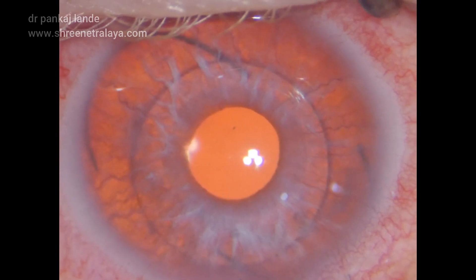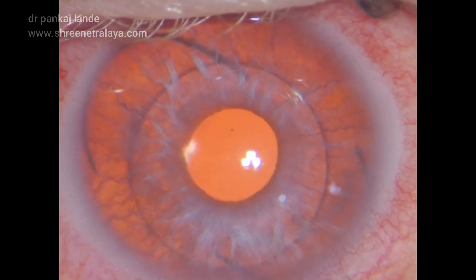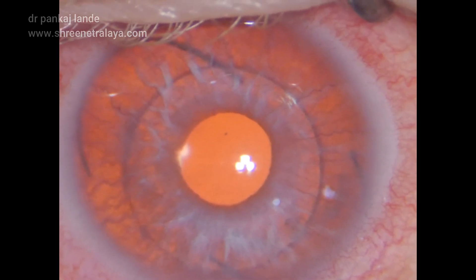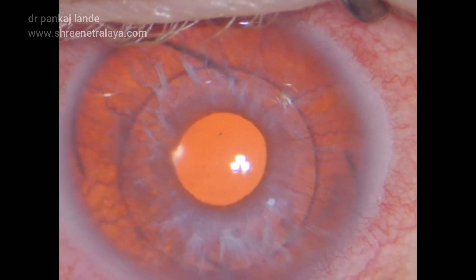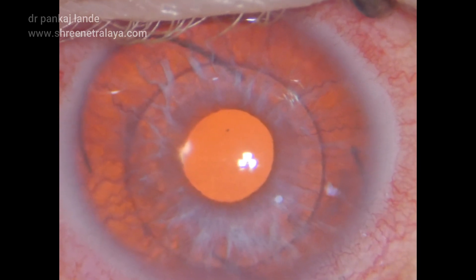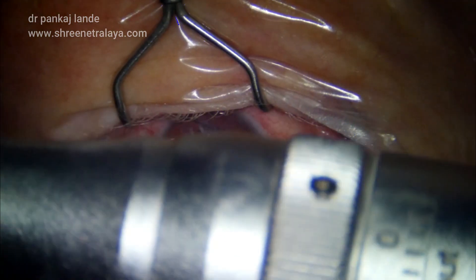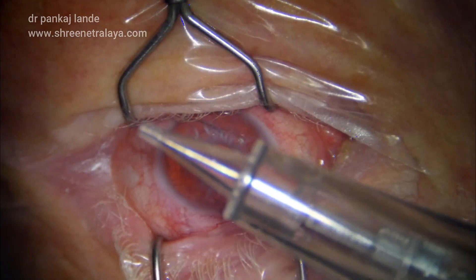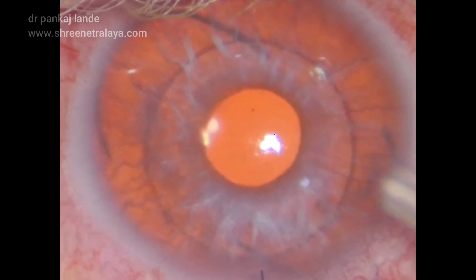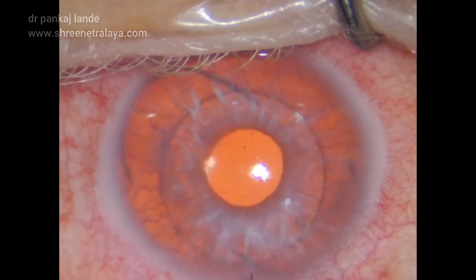There are many techniques for performing tattooing. Tattooing can be done with a tattoo gun and ink, as I have done in this particular case, which I feel is least traumatic. The second technique is to create lamellar pockets and use soot in that pocket. Here I am using a tattoo gun which has a calibration so that needle depth can be adjusted according to my requirement.